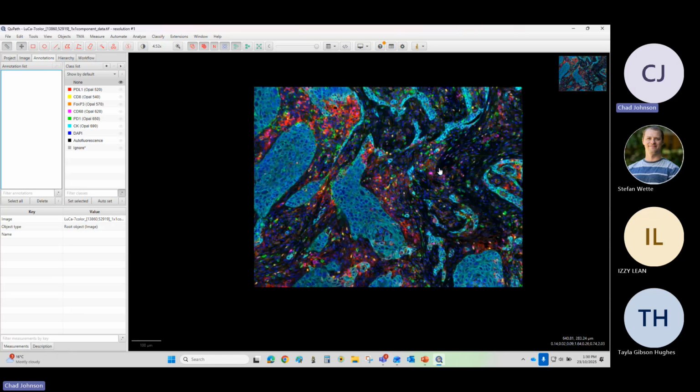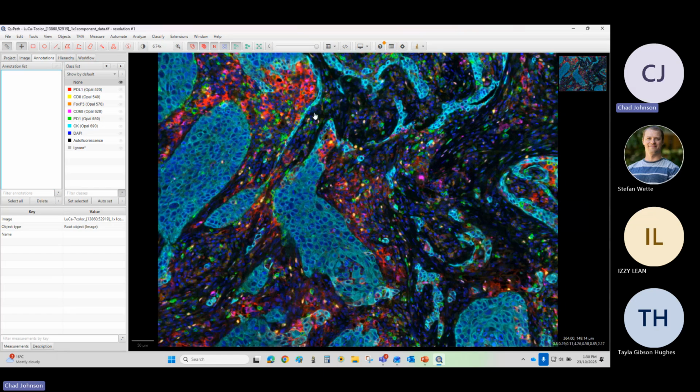Cell detection. So before QuPath can start determining what is and isn't a positive cell, we have to show QuPath where the cells are. Now, I feel that there is a little bit of a bug in version 0.6 going from 0.5. Typically what you would do is on the original image, before you started splitting the channels into individual training images, you would create your cell detection here and then duplicate the image for as many channels as you wanted to select, and that detection would then propagate to the rest of them. It doesn't seem to do that, at least very well.